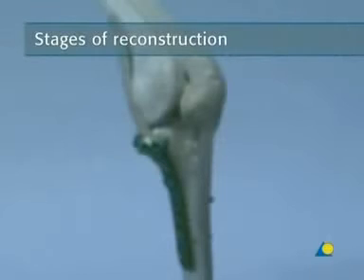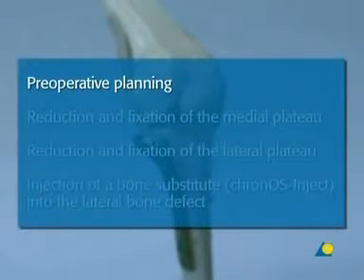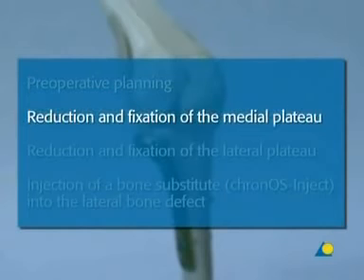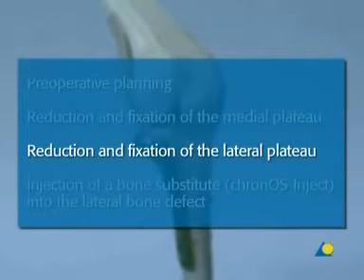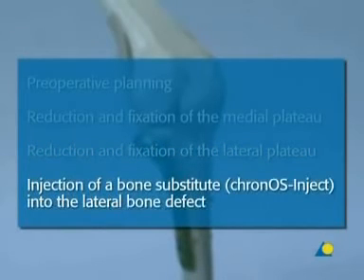Stages of reconstruction: preoperative planning, reduction and fixation of the medial plateau, reduction and fixation of the lateral plateau, injection of a bone substitute, Chronos Inject, into the lateral bone defect.